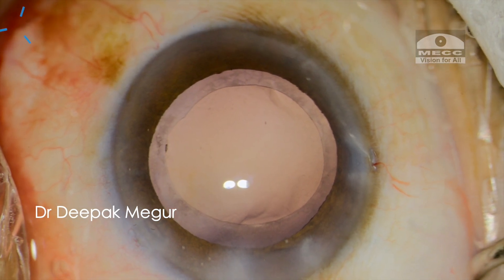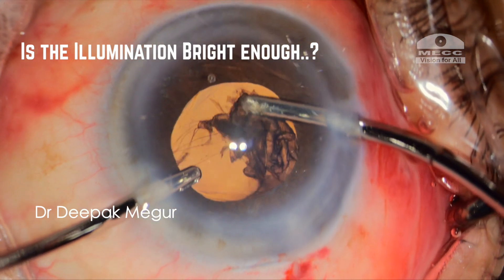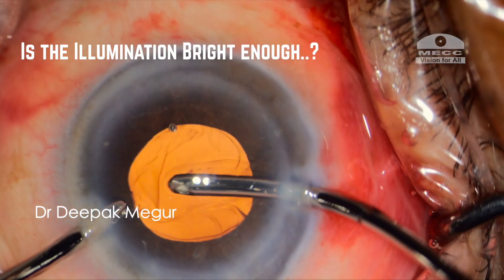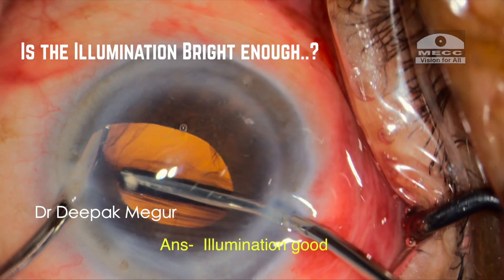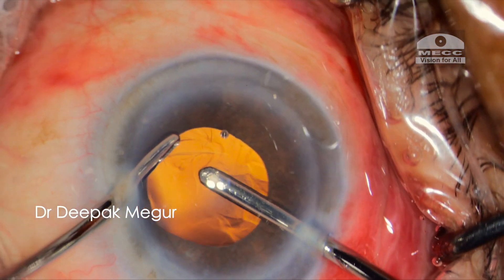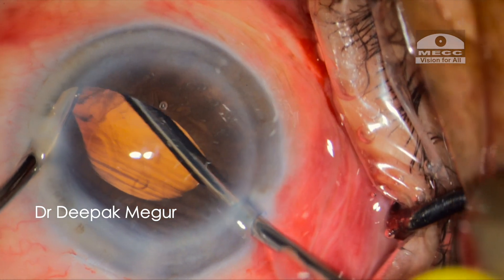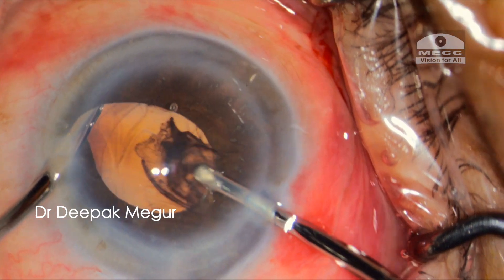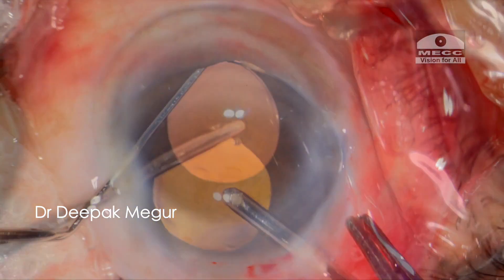Is the illumination bright enough? Yes, there is no problem with it — we can control the illumination with the provided regulator. In fact, I think one significant and unique advantage with this device is that even in a scenario where the microscope illumination is lost because of some reason, every step of the surgery can be completed with the sole illumination from this device itself.